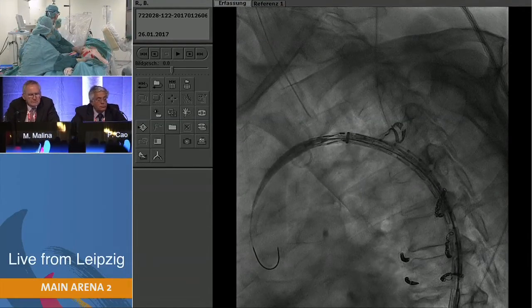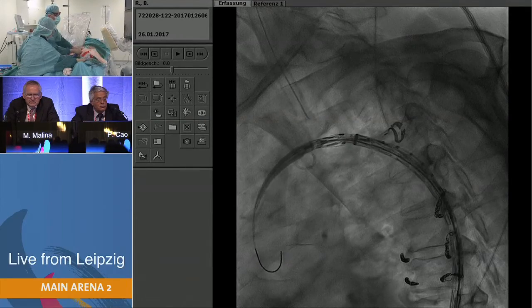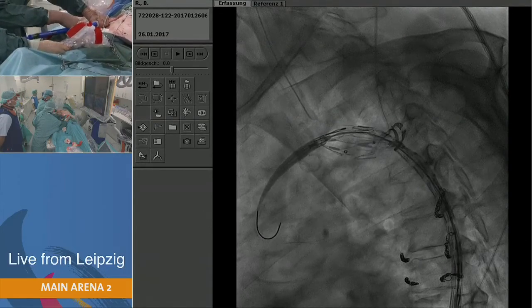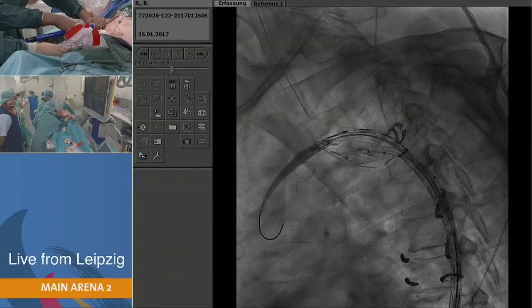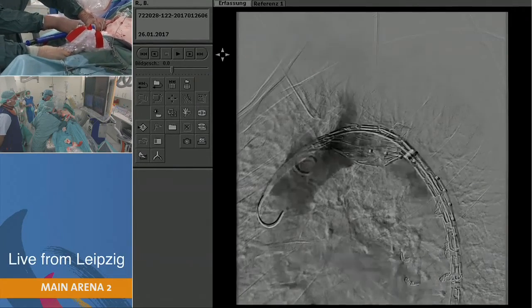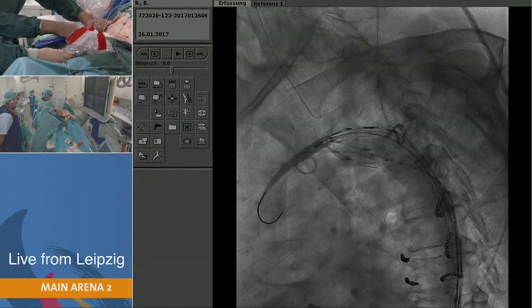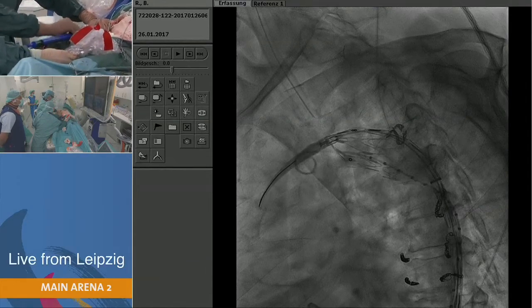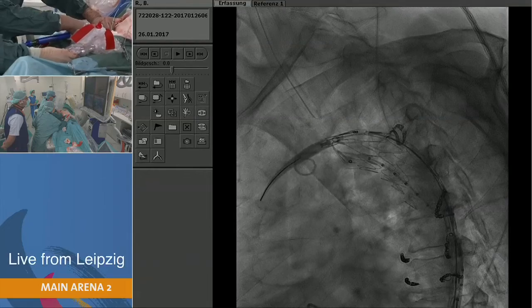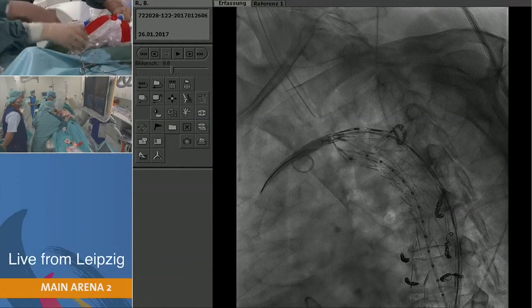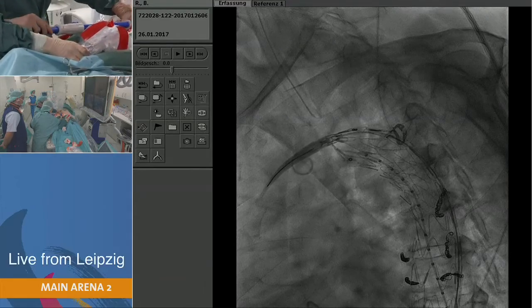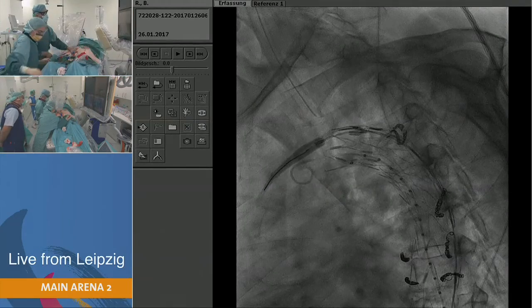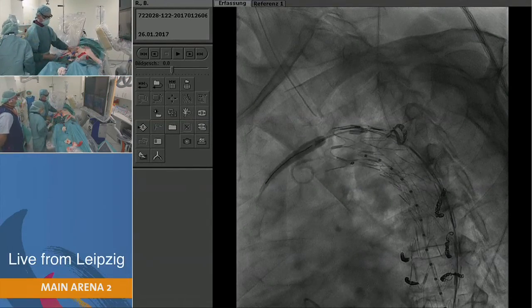The rapid pacing is on and pressure drops to a very low level. Apnea requested. Doing another shot here. Going back a little, performing a fast release of the rest of the graft. Pacing off — hold on, first I had to release the proximal strut. It landed beautifully.